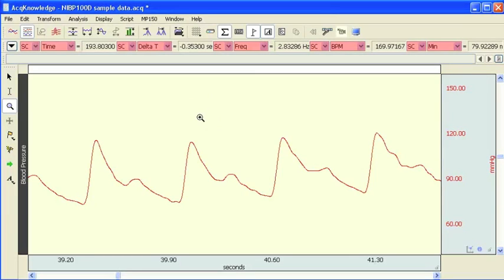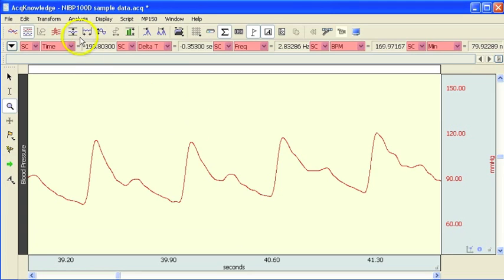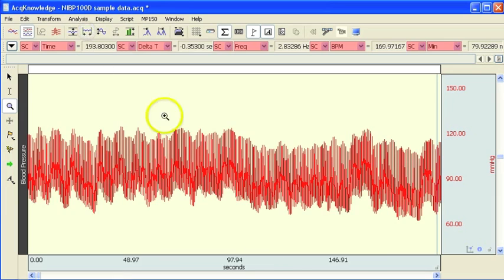The following screencast will show how to use the Biopac automated blood pressure analysis routine. In order for this routine to work you need to have a file with a good continuous blood pressure waveform.